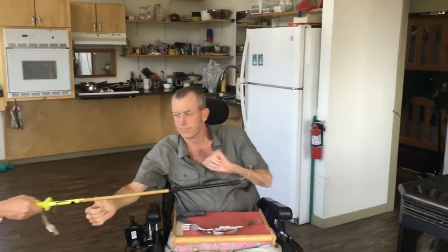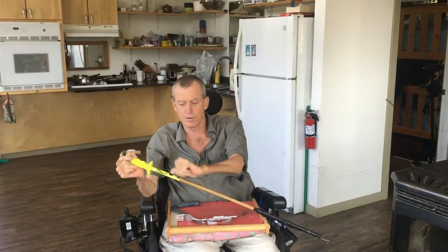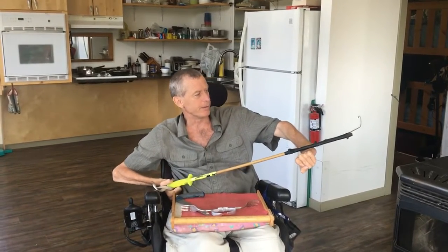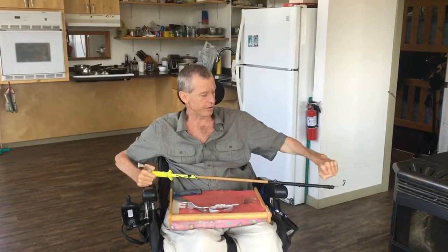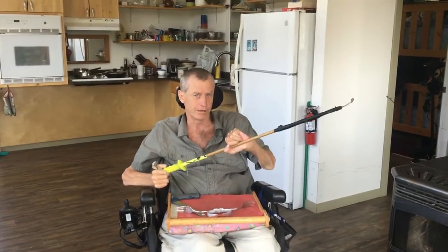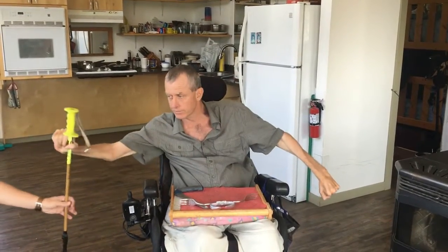Now the next one, this is a broken ski pole. So there's tons of them around. So I just stuck a wooden dowel up the shaft of it here, put a little set screw in it. And on the end, I formed a hook out of a metal coat hanger. I just doubled it up, and then I just formed up a hook, put a couple zip ties on it, and tied it up. And it grabs things off a shelf pretty nice. And this one works really good for getting things off the grocery shelves. You can go like that, pick things down, pull things out.